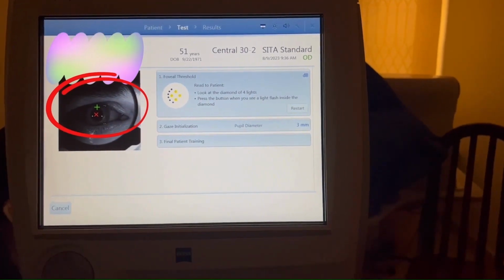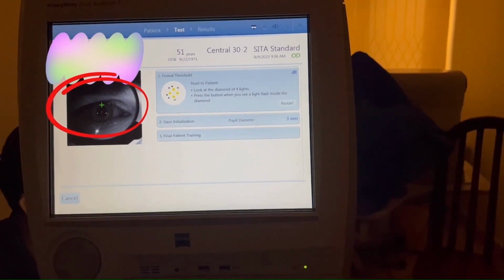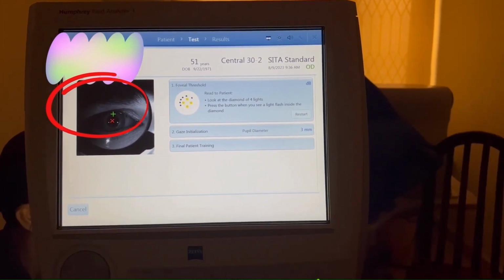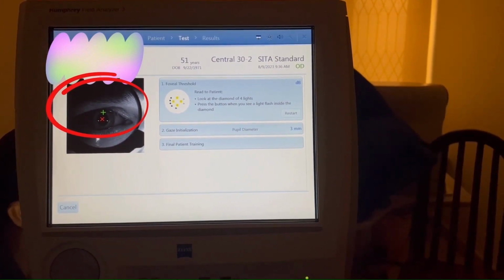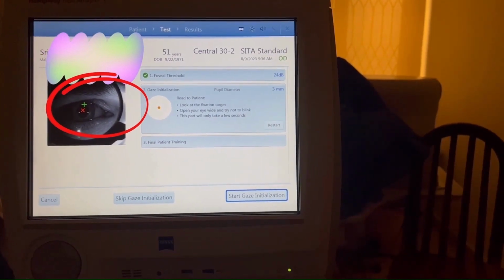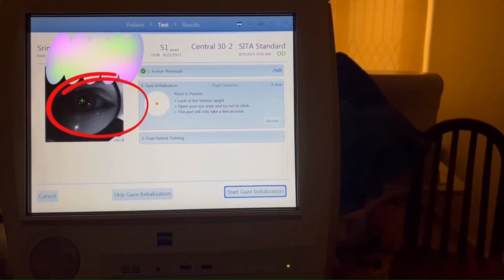It is important to align the patient's eye to the center of the trial lens. A red X indicates the pupil location when it is not centered. A green plus sign indicates the center of the lens position. The X of the pupil location turns green when it is centered and overlaid with the green plus sign of the lens. The resulting centered icon looks like a green star.